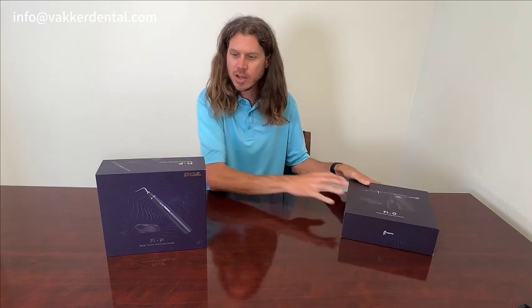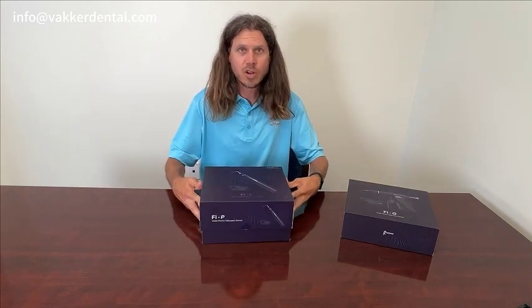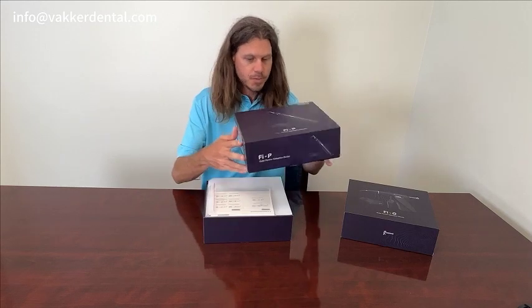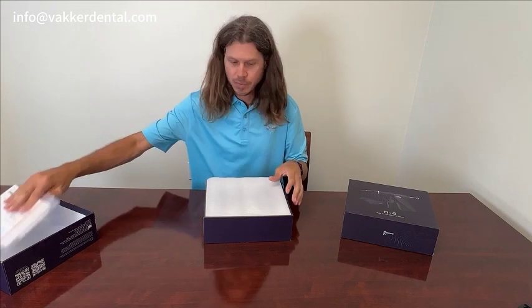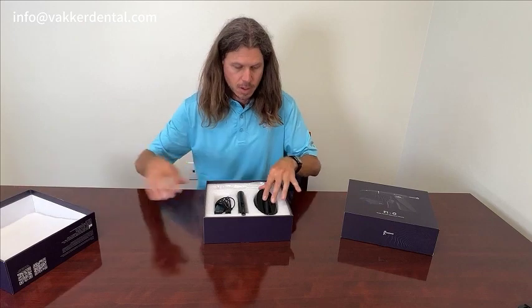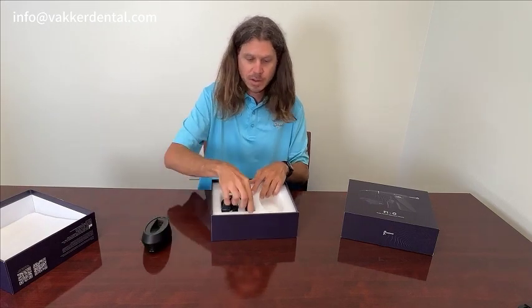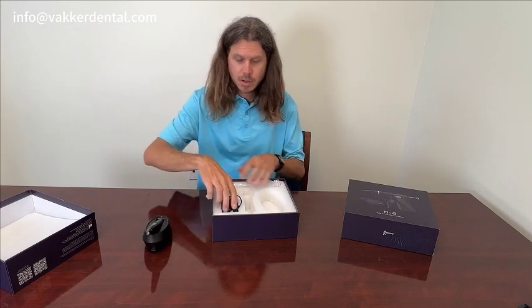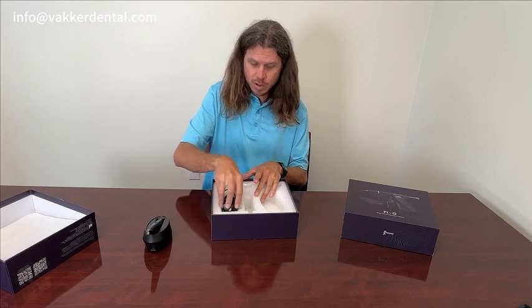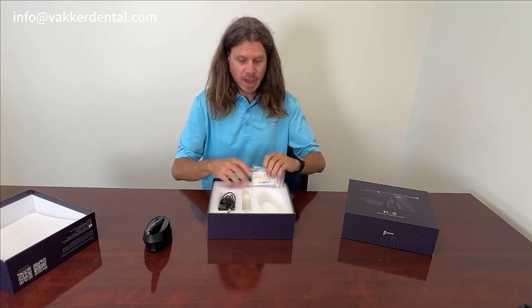Let's go ahead and open up our pen. This comes with a one-year warranty. It does come with a warranty card and an instruction manual. It comes with the charging station, the pen handle, the charging cord, and then four assorted packs of tips.